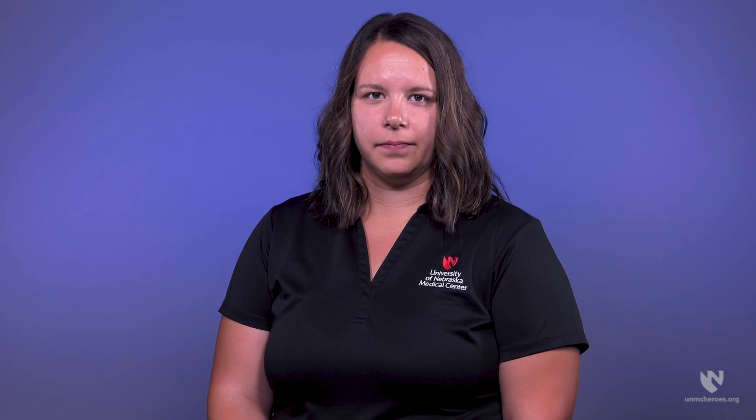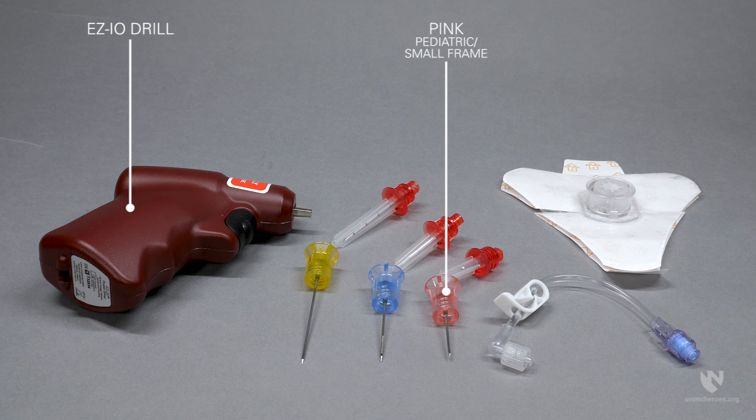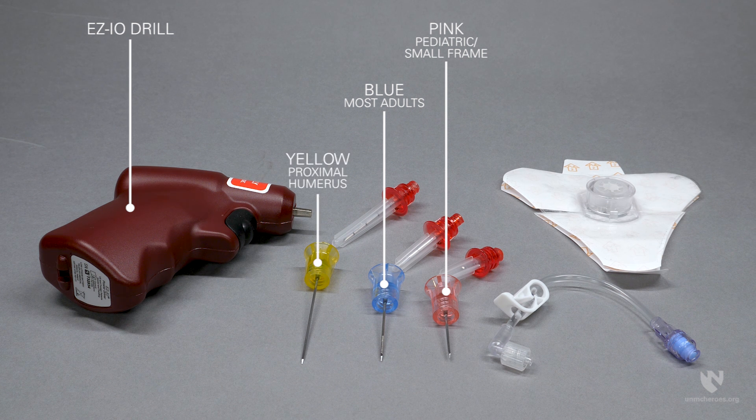We will review the supplies needed to place an IO access with a powered drill system. A typical EasyIO kit includes the following: an EasyIO drill and needles. There are three different needle colors which designate the length of the needle. A pink needle for pediatric patients or smaller framed patients. A blue needle, generally used on most adult sites. And a yellow needle, which can be considered for the proximal humerus site in areas with excessive adipose tissue.